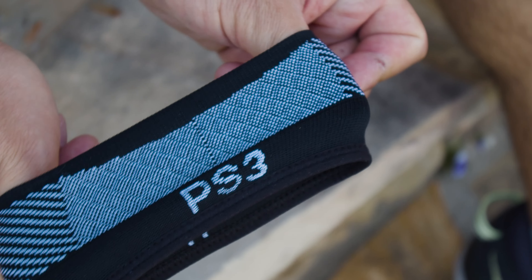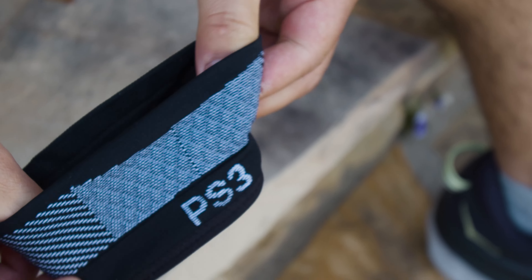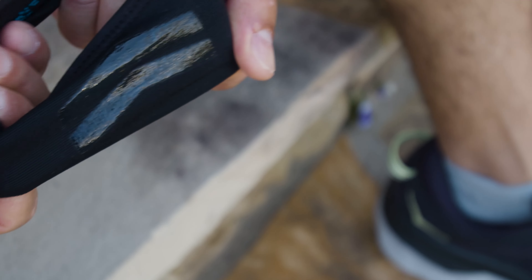Before ordering, it is important that you measure below your patella for accurate sizing and refer to our sizing chart to determine the proper fit.